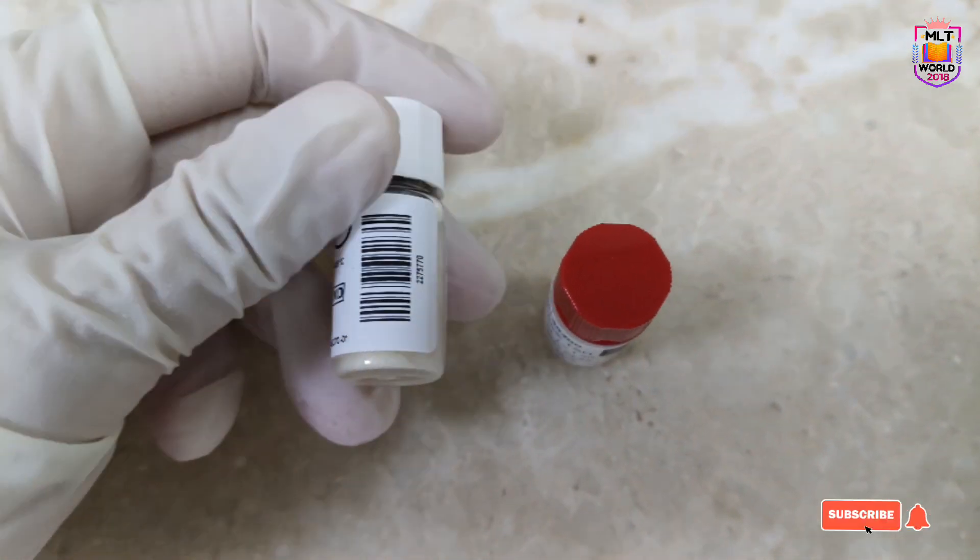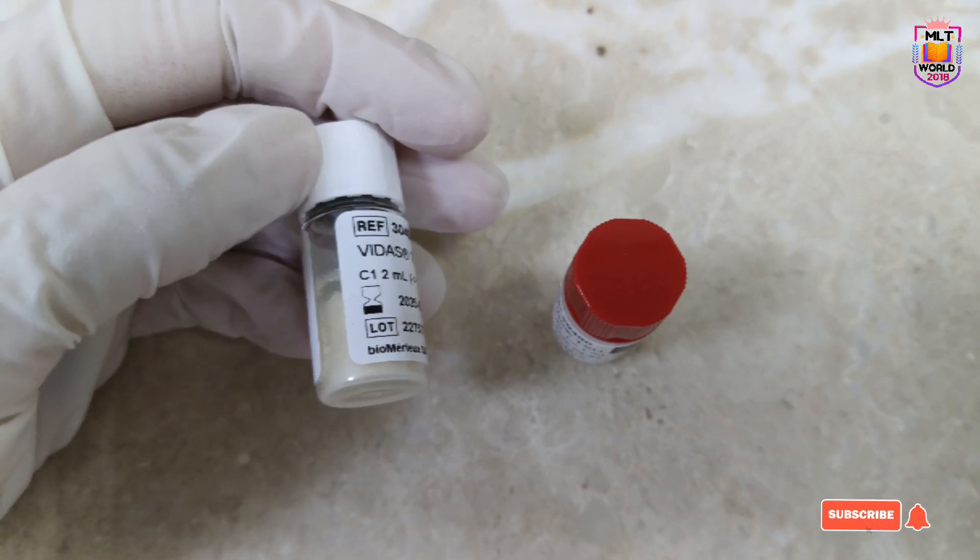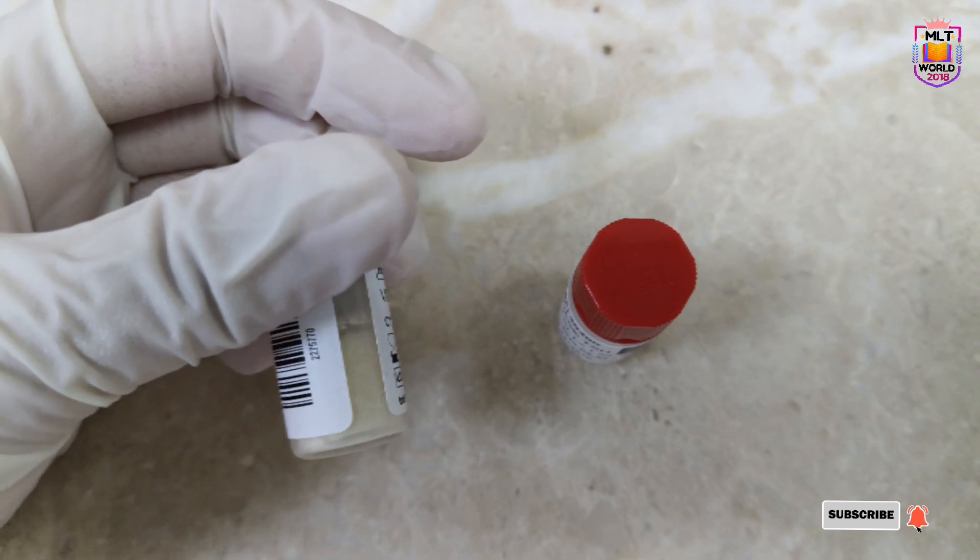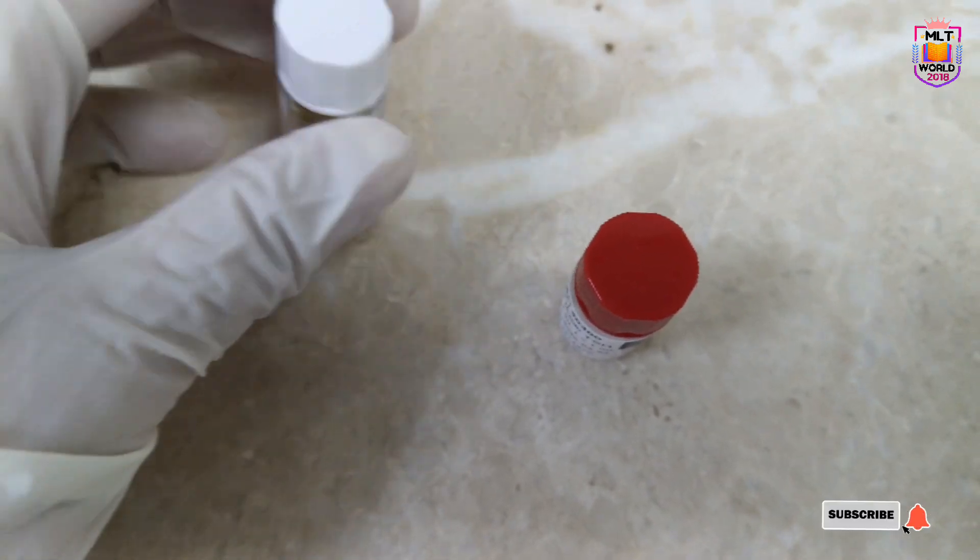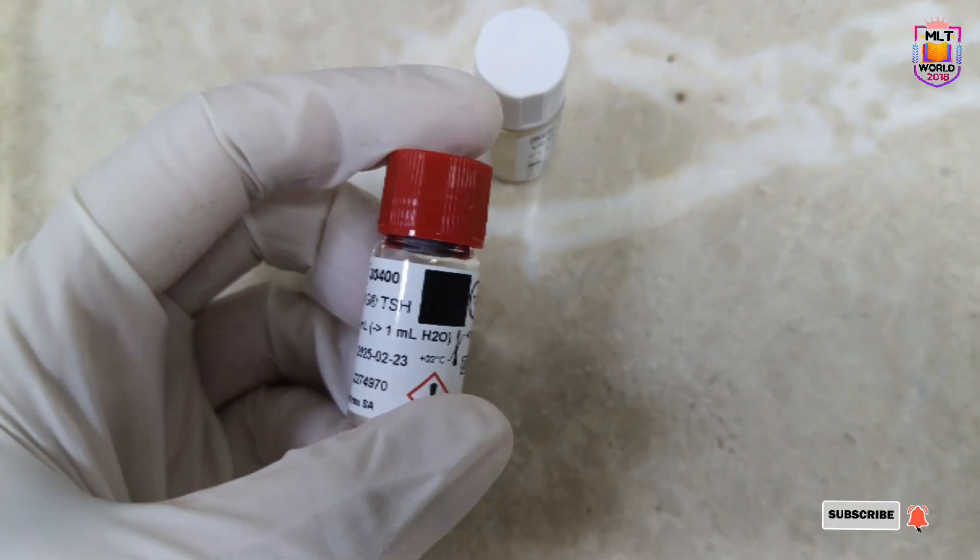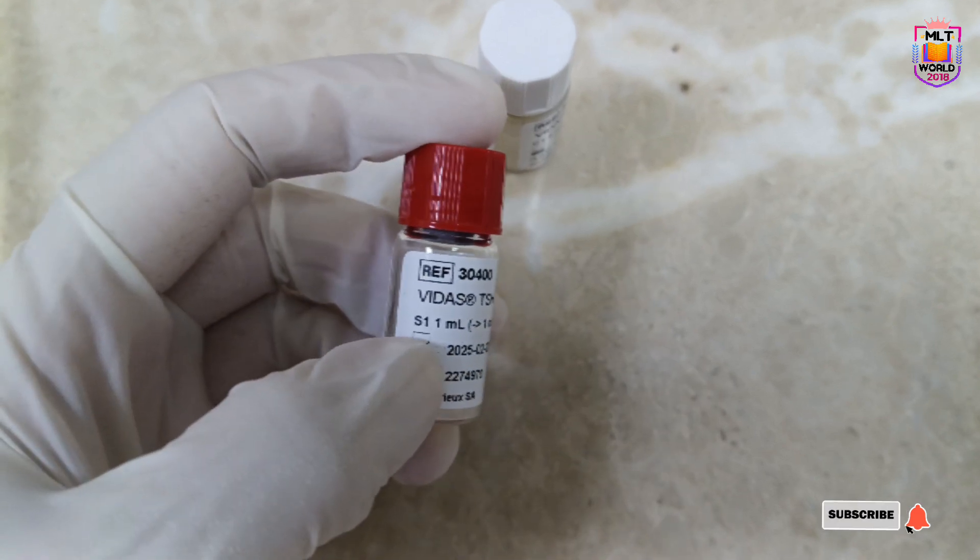Welcome back to MLT World. Today I'm going to share how to dilute calibrators and controls in the laboratory. When controls and calibrators come in lyophilized form, we normally have to store them at 2 to 8 degrees centigrade.